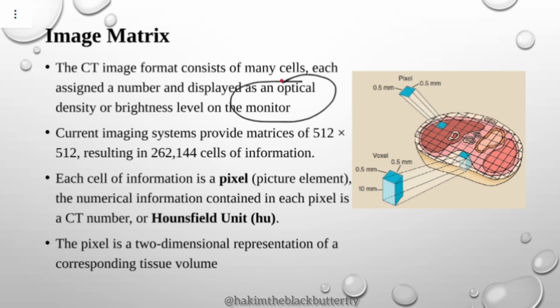If you have a patient here, we are going to assume a single photon ray, like a pencil beam of intensities. It is going to pass through a patient. A CT, in fact, has two detectors.